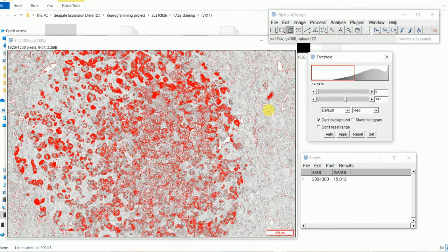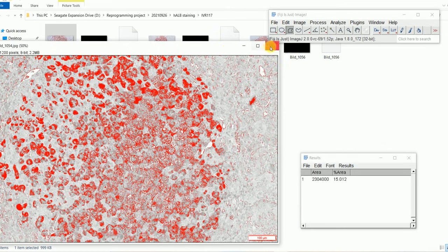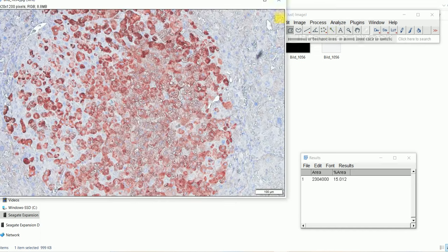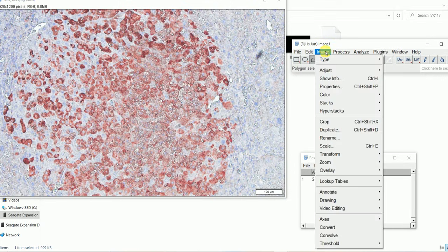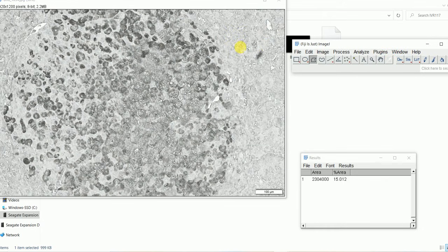To get rid of that, what we can do, I will just get rid of this one also. I will just select no. I'm just going to start everything over. So I will drag this one here, and this image I have dragged here. I can go to image and then type, and if I click on 8-bit, this is also appearing black, but this I have to get rid of, because in my original image something black was already appearing. I want to get rid of that.